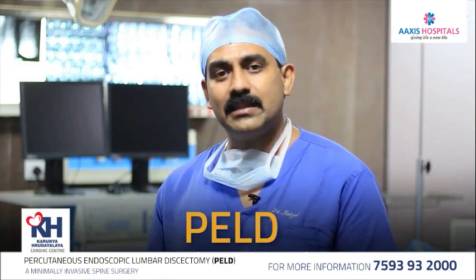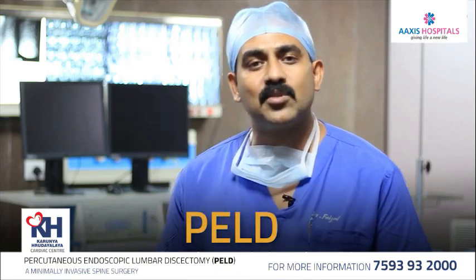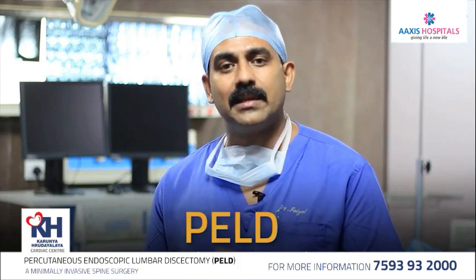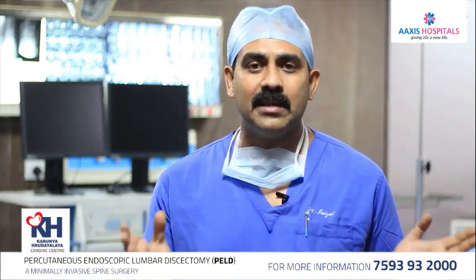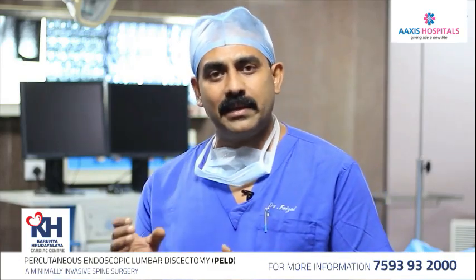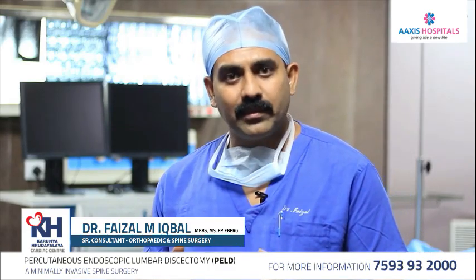Each word has its meaning. Percutaneous means through the skin. Endoscopic, by using an endoscope. Lumbar, we utilize the lumbar spine for major procedures, and it's a discectomy. So it's a percutaneous transforaminal endoscopic lumbar discectomy. You utilize the normal God-given foramens of the spine to get into the disc and get the disc diseases cured.